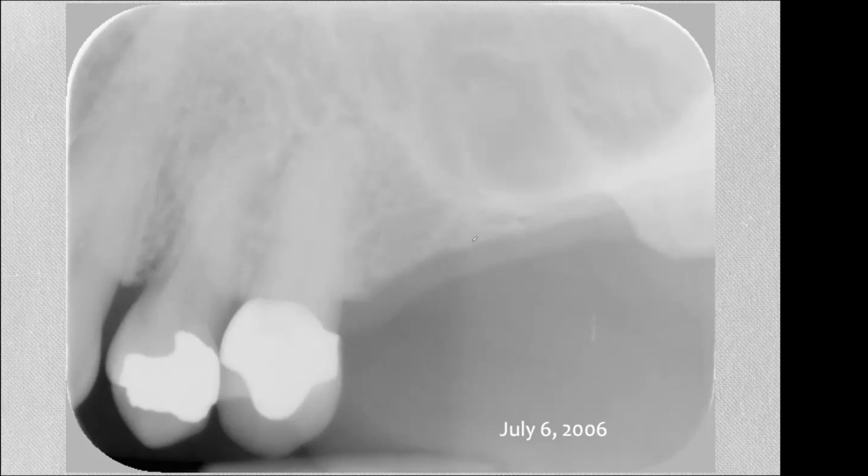If you were to place a platform type implant, how would you place it? Will you shave the bone down, thereby compromising the health of this tooth? Or would you try to graft the bone vertically, which is very unpredictable? And in my hands, it yields almost always less than a quarter of what you hope for. Whereas using the Bicon implants with the sloping shoulder, the internal sinus lift, and a sinus lift abutment, we're able to achieve that with minimal fanfare, a lot more relaxed and much easier.